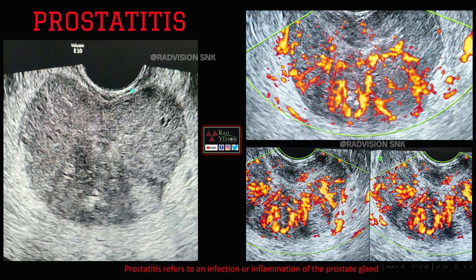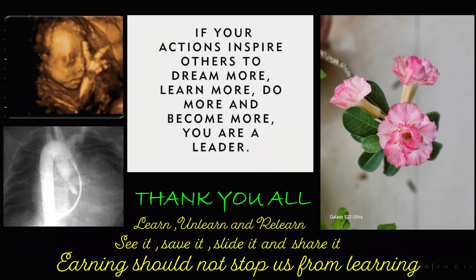The last case: on transrectal sonography you can see there is an enlarged prostate with multiple hypoechoic areas. On color Doppler, you can see raised vascularity within the prostate, and sometimes hypoechoic areas with abscesses. Whenever you see an enlarged prostate with raised vascularity, definitely suspect prostatitis, which is infection or inflammation of the prostate gland. Thank you all.